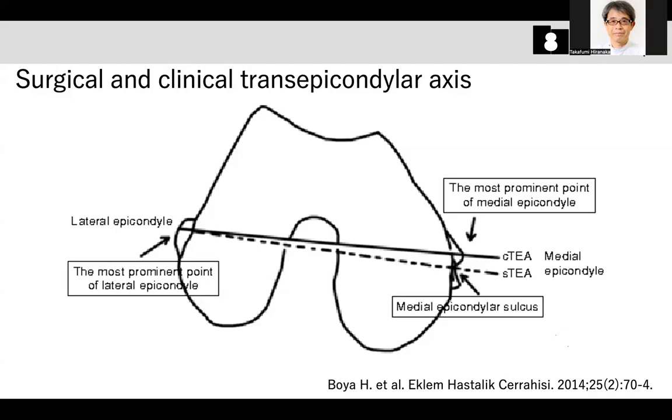But the problem of the CT scan is that the slice should include four reference points here, and this is the lowest point and the lowest point. So it is virtually impossible to capture all four perfect reference points in the same frame.